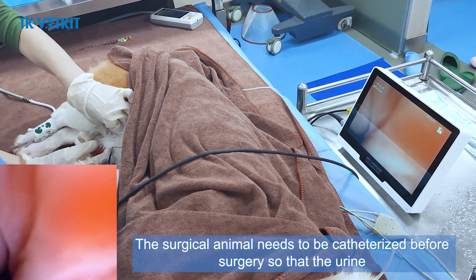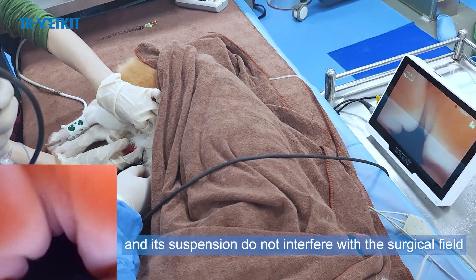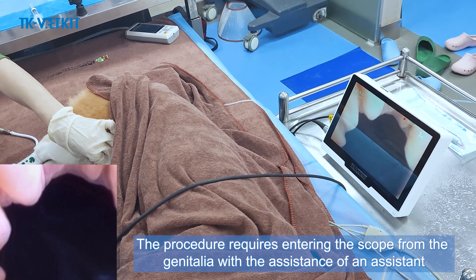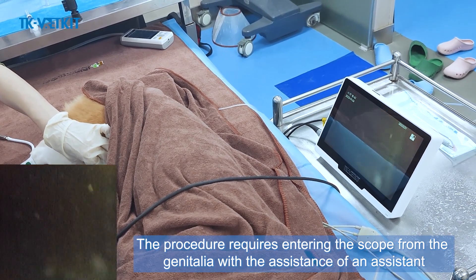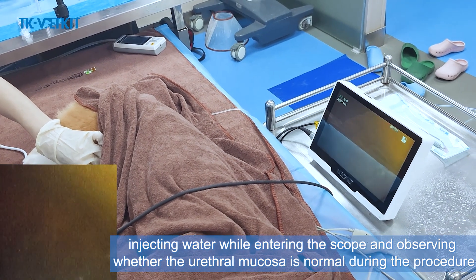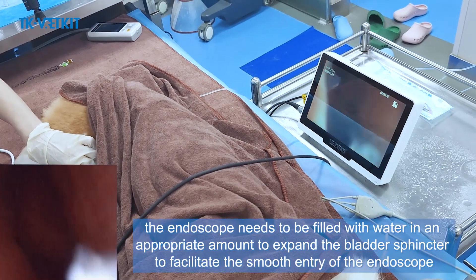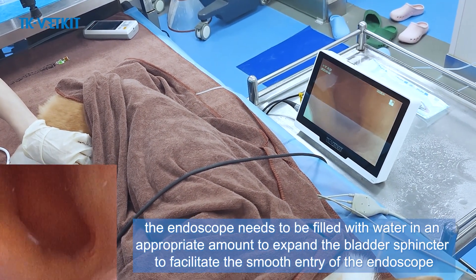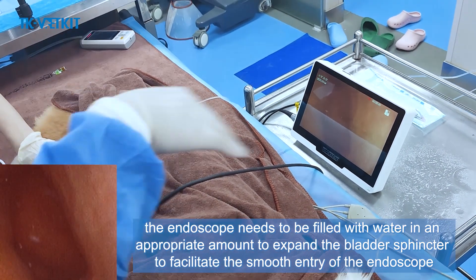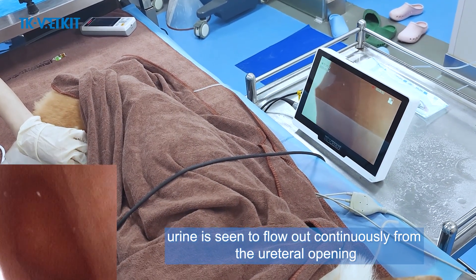The surgical animal needs to be catheterized before surgery so that urine and its suspension do not interfere with the surgical field. The scope is entered from the genitalia with an assistant injecting water while entering, observing whether the urethral mucosa is normal. Before entering the bladder, the endoscope needs to fill the bladder with an appropriate amount of water to expand the bladder sphincter. When the endoscope reaches the ureteral opening, urine is seen to flow out continuously.